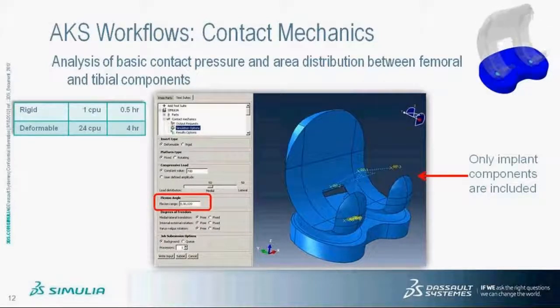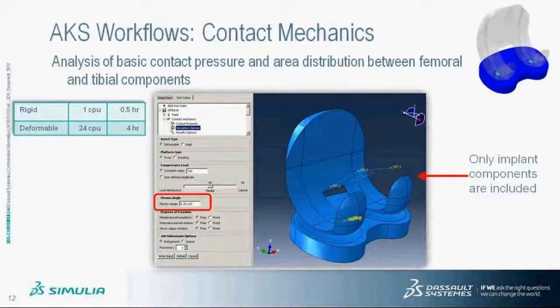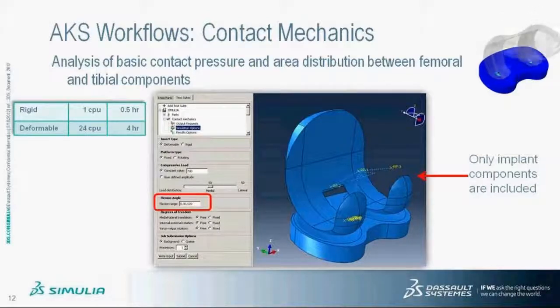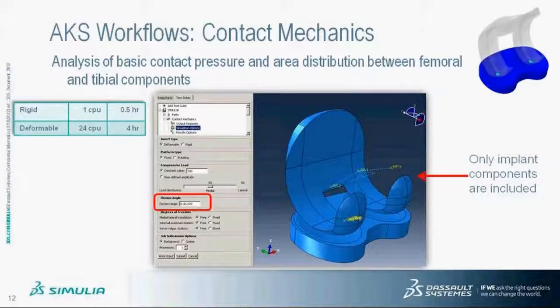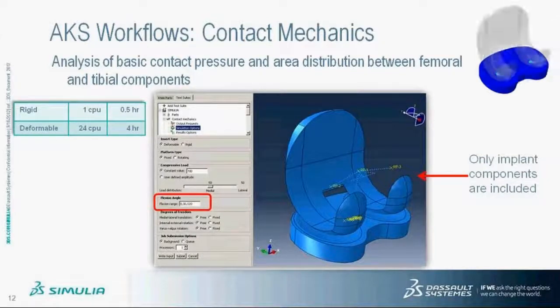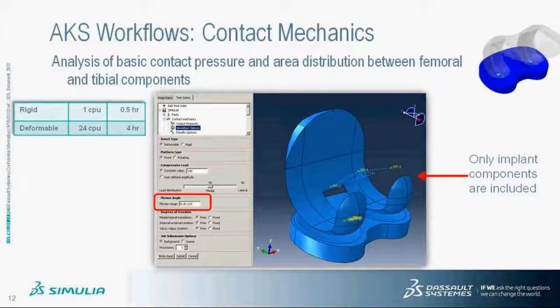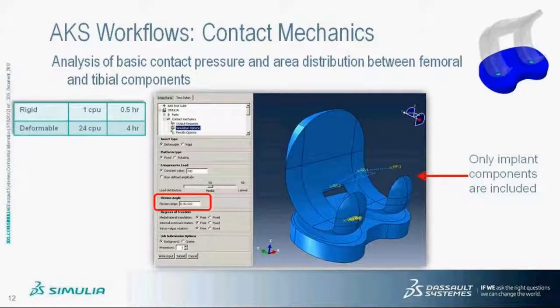During the analysis, a compressive load is applied on the femur component. The value can be either constant throughout the analysis step or varied using an amplitude curve. The distribution between the medial and lateral side can be specified using a slider bar. The femur component is flexed to a user-specified flexion angle. The user specifies the beginning flexion angle, end flexion angle, and output increment. For example, flexion from zero to 120 degrees with output at 30, 60, 90, and 120 degrees.